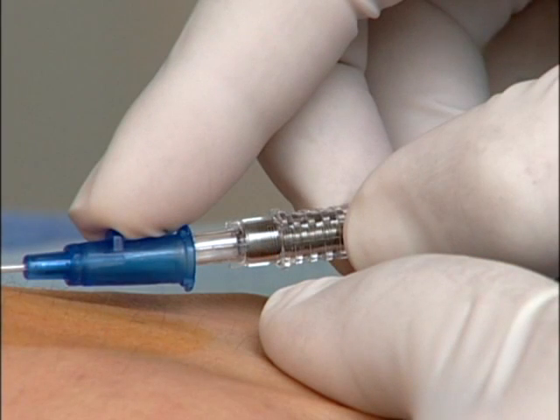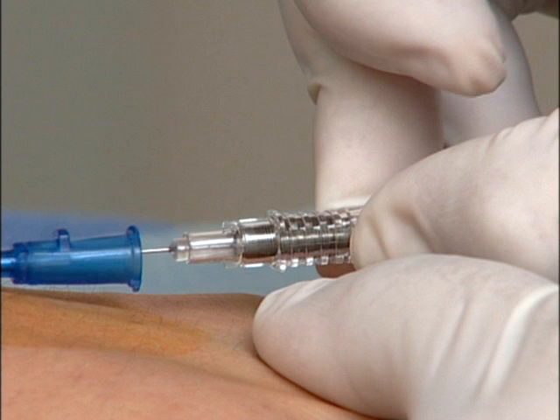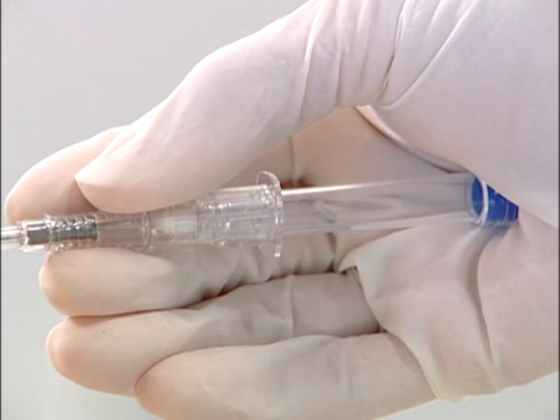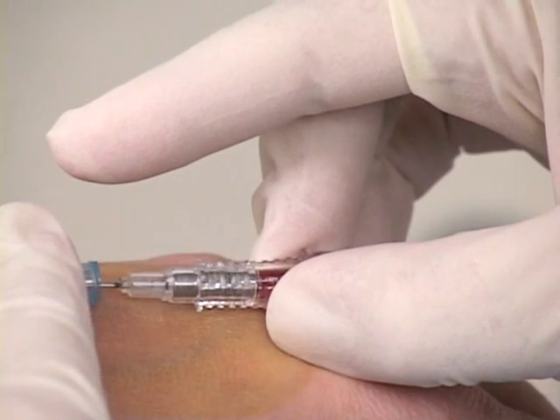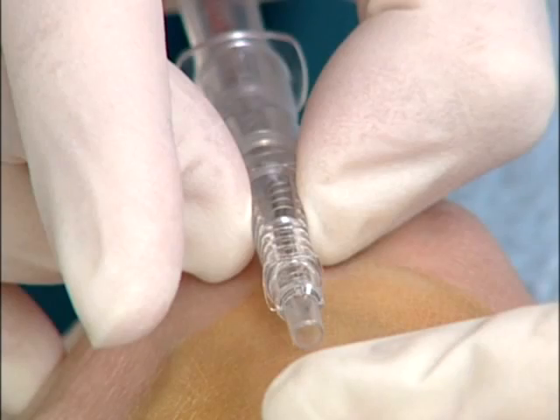Holding the flashback chamber stationary, disengage the hub from the introducer needle, advancing the catheter into the vein. Do not reintroduce the needle into the catheter at any time. Before withdrawing the introducer needle from the catheter, retract the needle. To do this, stabilize the color-coded end of the housing in the proximal portion of your palm and pull back on the finger grips of the housing. The needle will retract into the clear housing.